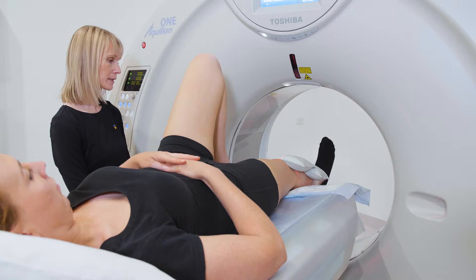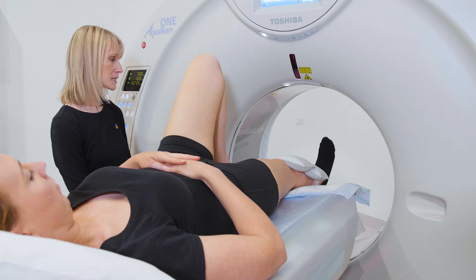The end of the table has been removed. It's very important to immobilize the lower leg. It's important to keep the motion as slow and steady as possible and to get the problem area in the middle of the acquisition.